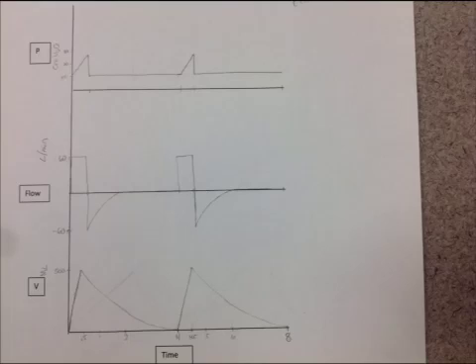Olga did a really good job here. So we start with our pressure waveform here at the top. The thing that we have to make sure we do is label our parts. See there where she labeled centimeters of water pressure. In this equation, we had 10 centimeters of PEEP, so we see that that's drawn in. Our peak inspiratory pressure was 25, so that's labeled right about there at 25.